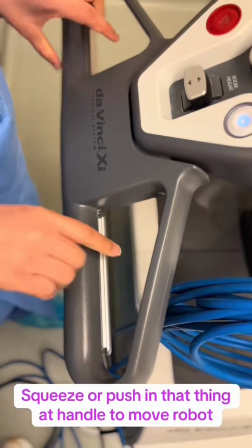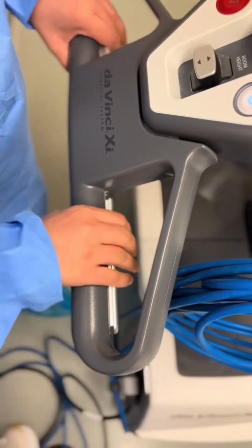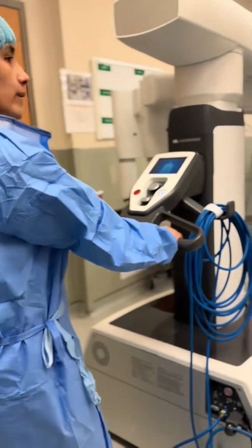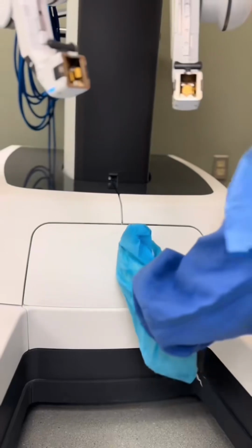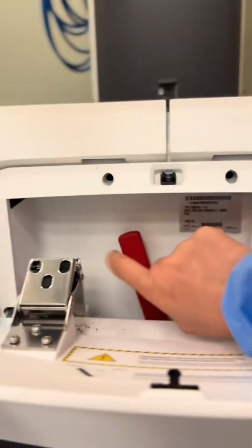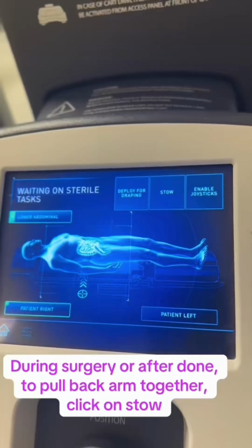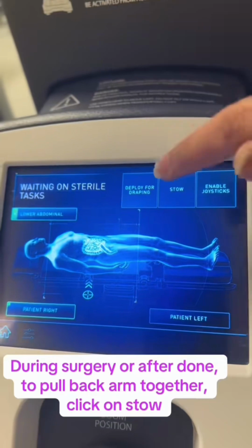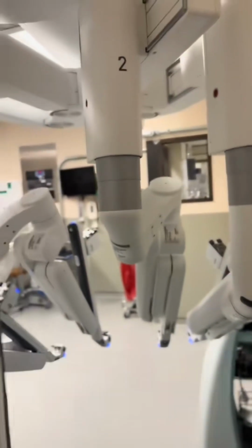And the important part of circulating is to drive the robot. Push in the thumb in the handle along with moving the robot. You can see there is a manual operator at the foot of the robot. So in the middle of the case or at the end, when the robot is disconnected and you need to put the robot together, click on stow. Now the robot will adjust its arms and boom accordingly.